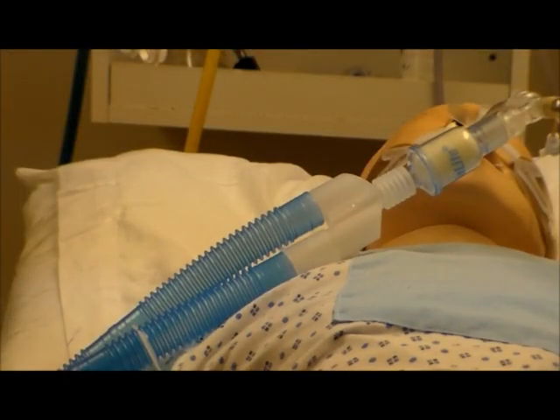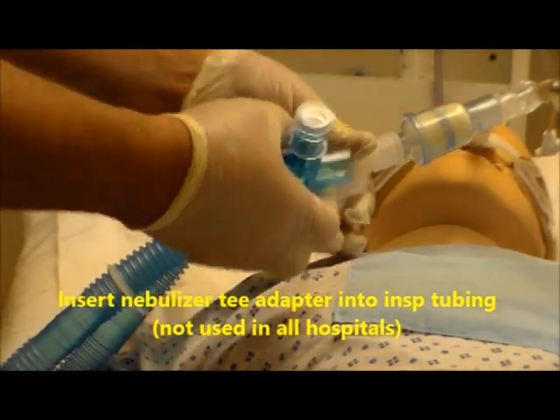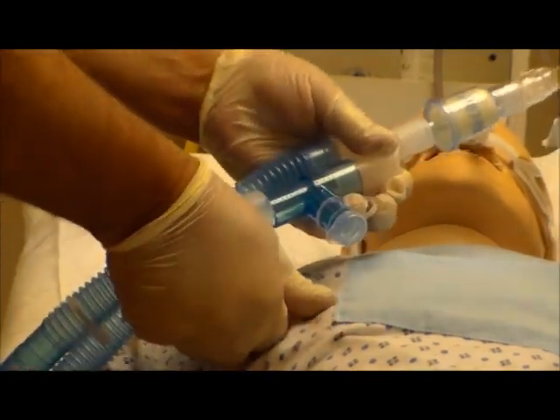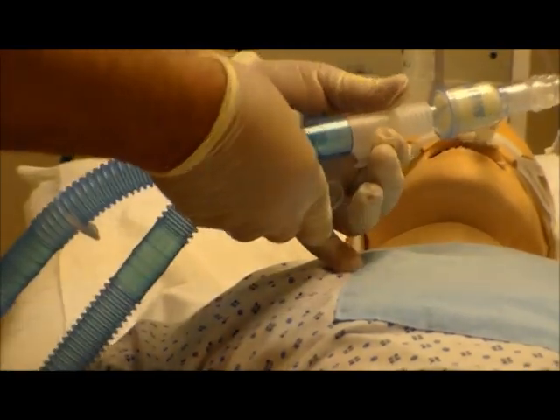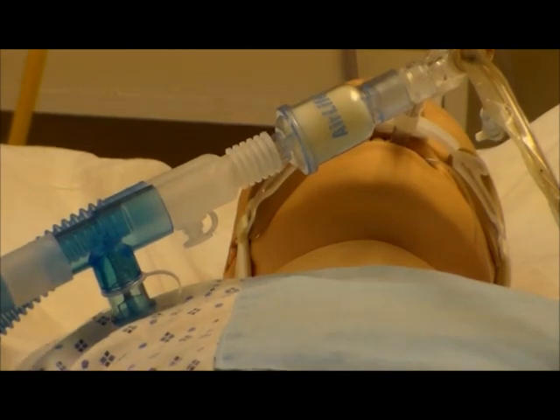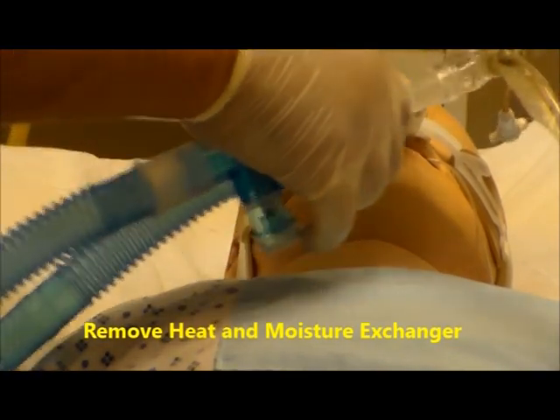The first thing you want to do is put in the T-valve adapter, which will help you to put the nebulizer in line. You want to make sure this goes on the inspiratory side of the circuit. Next you want to take out the HME, as leaving that in line would prevent the patient from getting medication.